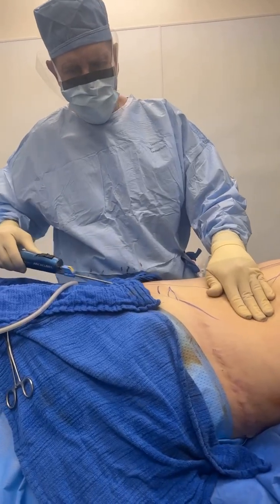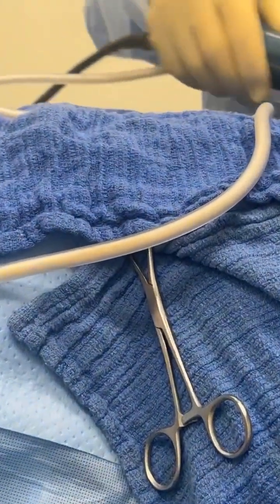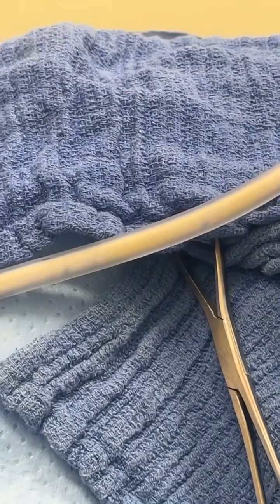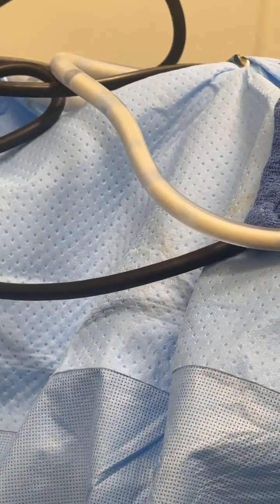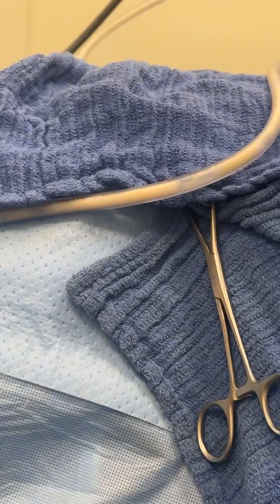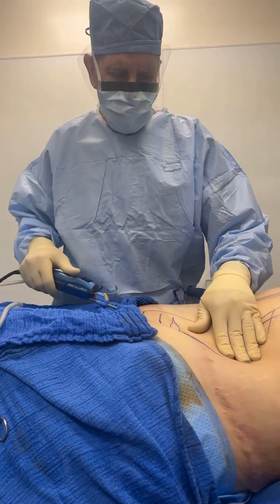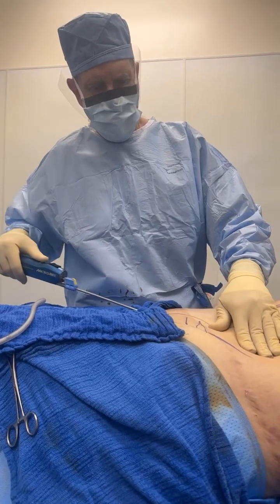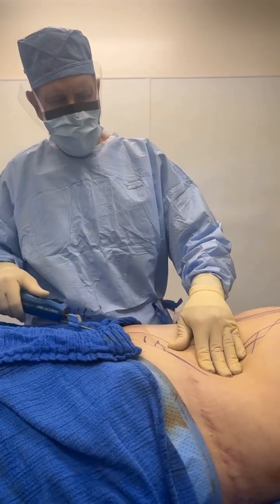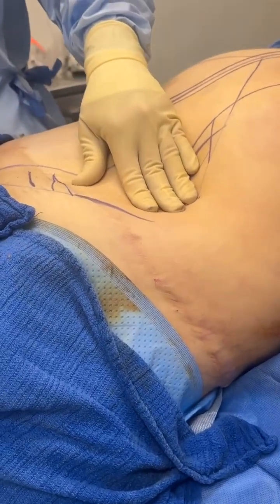So this beautiful bloodless yellow aspirate consisting of pure fat is obtained by multiple things. Number one is what the patient does. We instruct all our patients not to take any aspirin-like medications, vitamins, or herbs of any kind for 2 weeks before and 2 weeks after the procedure. Number two, the tumescent anesthesia that we use has epinephrine in it, and it clamps down the blood vessels. Number three, and probably most important, we wait a good hour after we put the tumescent anesthesia before we start the procedure, so the epinephrine has time to act and vasoconstrict the blood vessels so that there is maximum vasoconstriction and minimal bleeding.